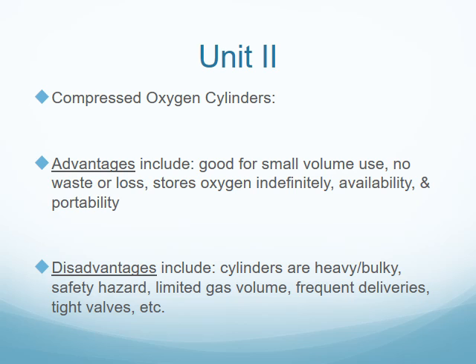Some of the disadvantages of it: cylinders are very heavy and bulky. You have to use safety precautions when you're storing it.